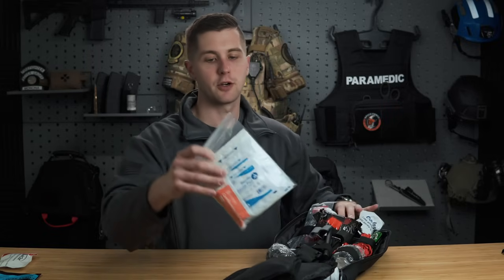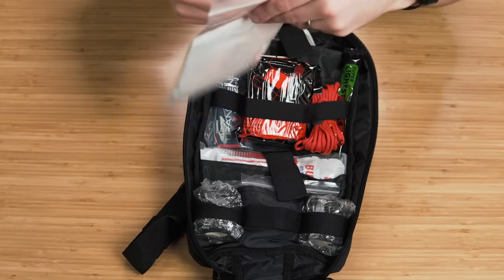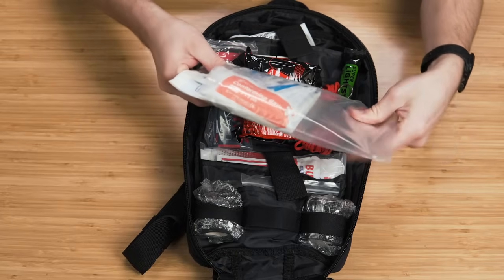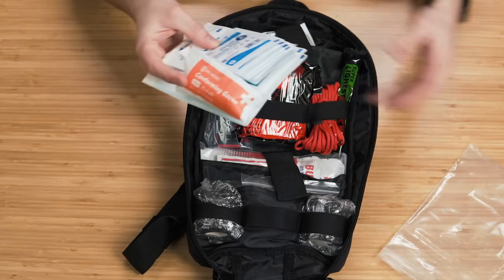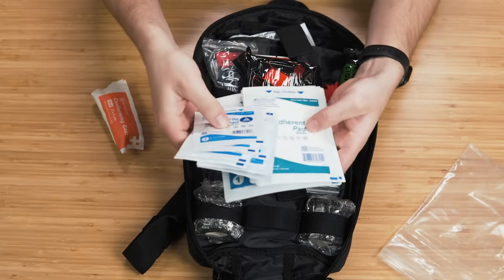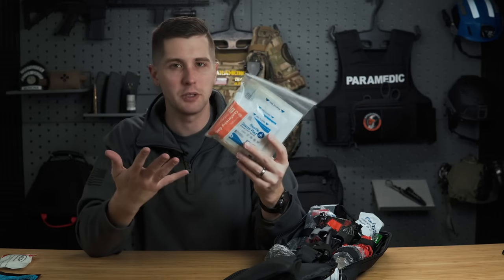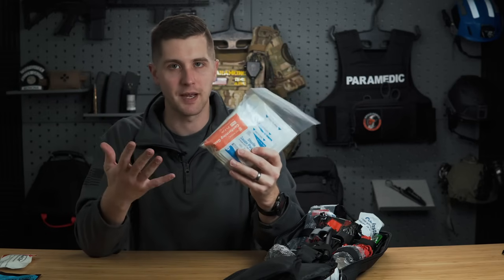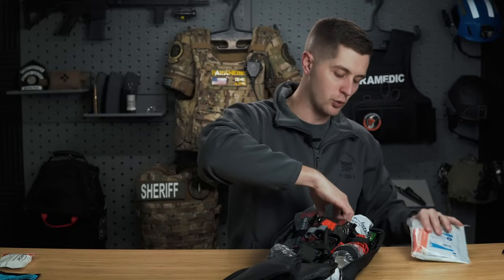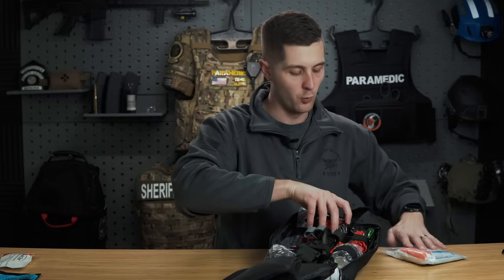And then right here, you have just kind of a miscellaneous pouch of a bunch of gauze pads. So most of our bleeding isn't life-threatening arterial bleeding. A lot of this is going to be your more minor wounds, you know, a head wound, somebody scrapes their arm, their leg. So really, when you're looking at a civilian kit, this is something that's really important to have. It's just a bunch of gauze pads that you can put on there, and then it's got some Kerlix wrap on it, which will allow you to address that bleeding in an efficient way.